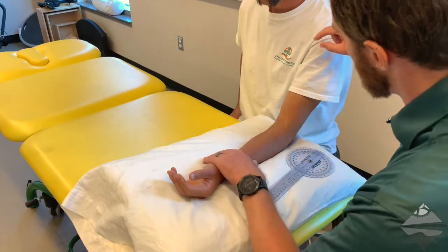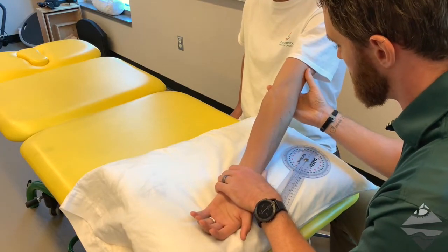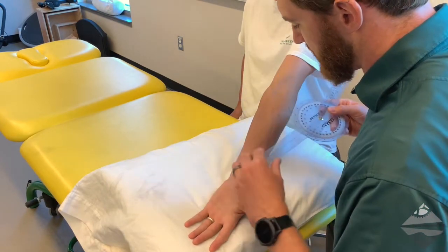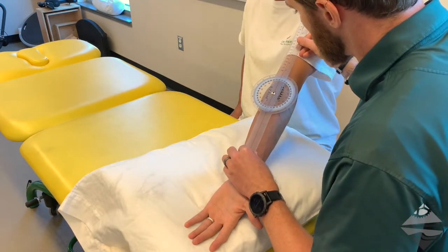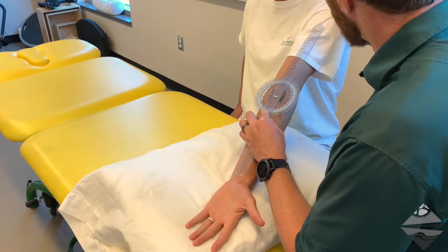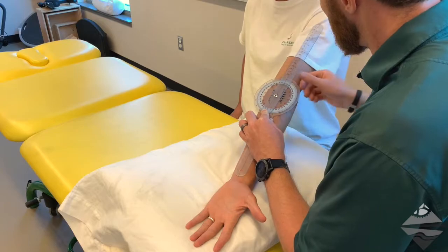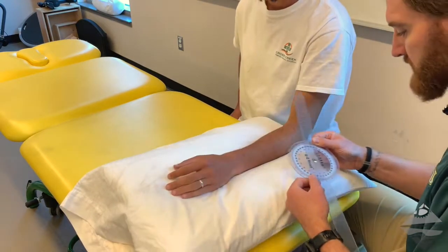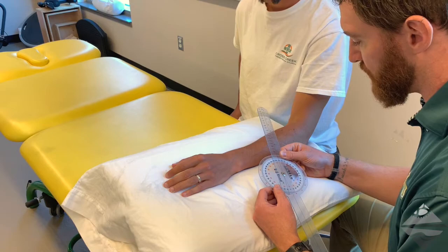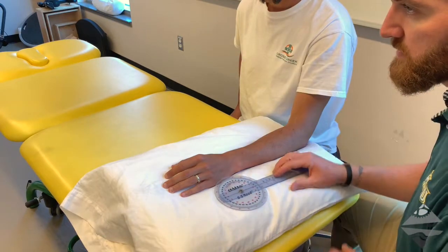Additionally, we want to look at carrying angle — the orientation of the humerus to the forearm, measured with the individual in an extended position. You're going to bisect a line right between your ulnar and radial styloid process; axis of rotation is the antecubital fossa, and you're looking for your bicipital groove anteriorly as you follow the humerus. About nine and a half degrees here — zero to 10 is normal for men, while women tend to have a slightly higher carrying angle, upwards of 15 degrees. Side-to-side comparison is helpful.